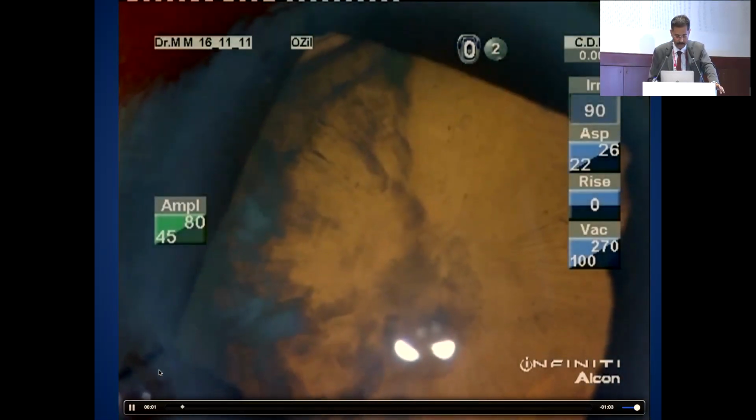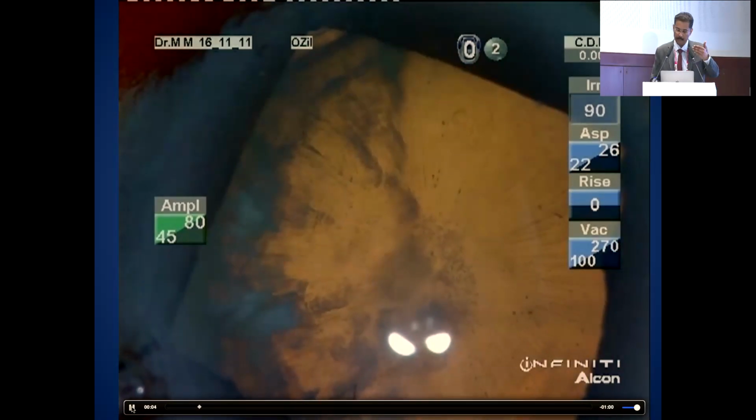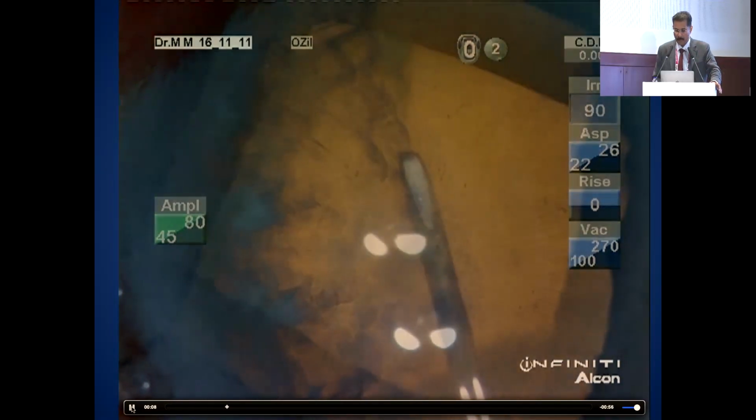So here is something which is seen in many of these shallow anterior chambers, PACGs and all those. See these anterior extended aberrant capsule, anterior capsule on zonules. When you do a capsular rhexis, you will go into these zonules and then it will not progress as you want it to. So when you see these, please release them off with a blunt, maybe a cyclodialysis spatula or a blunt Sinskey. Don't damage the anterior capsule. It can be released off.